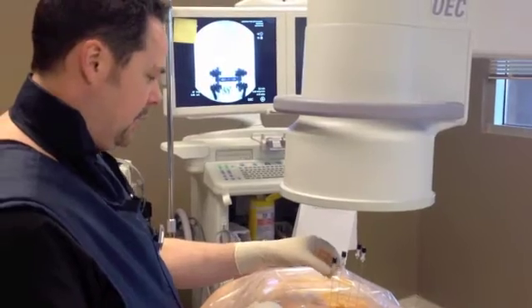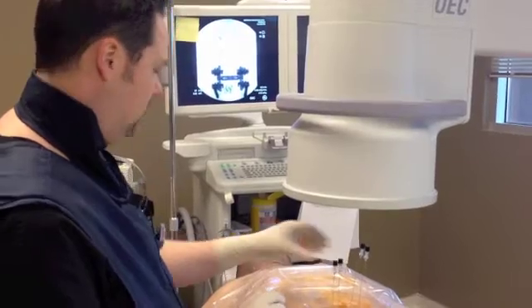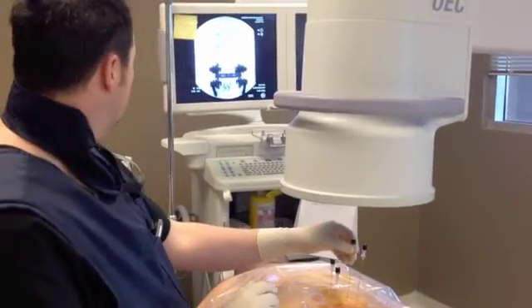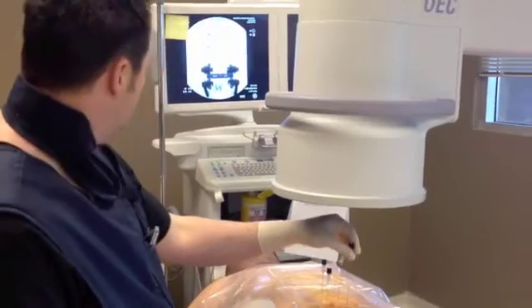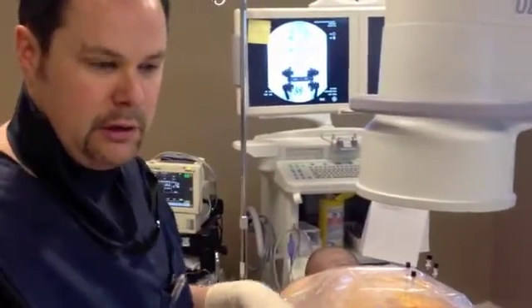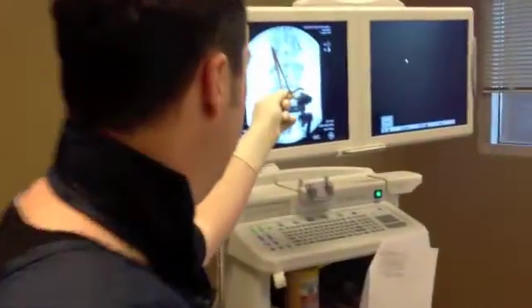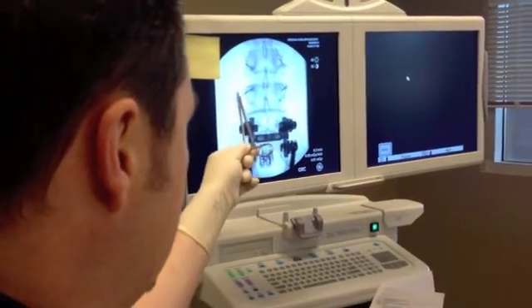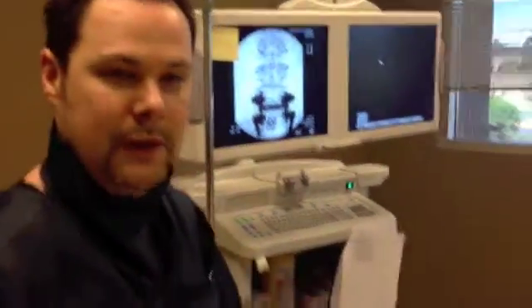Okay, so we'll just steer that right to that place where we talked about. We put somewhere between one cc to half a cc in that location. The medicine should spread around. I'm going to show you right where the medial branch nerve lies — right there. There's a superarticular process, transverse process, right at that junction. That's how you do the needle for that spot.